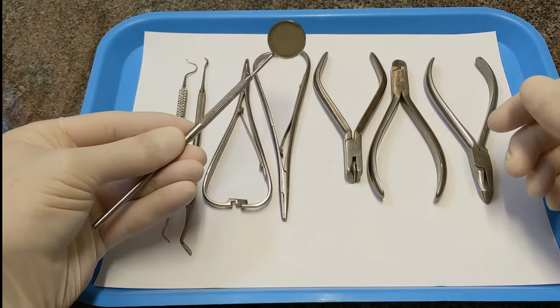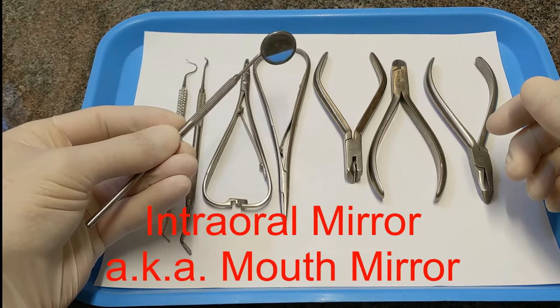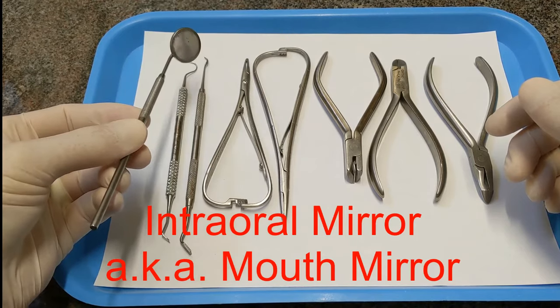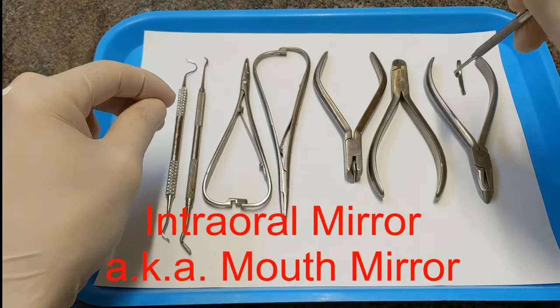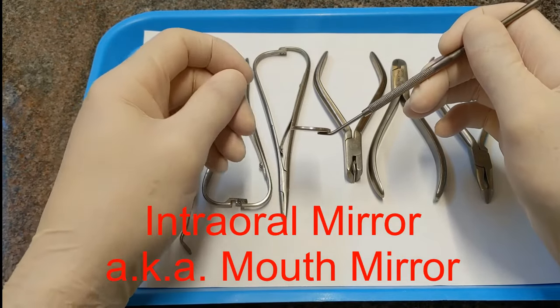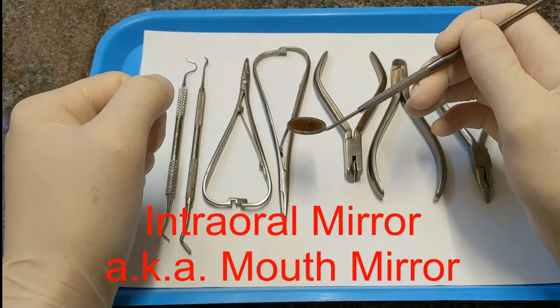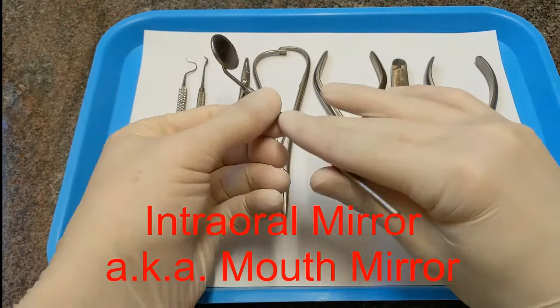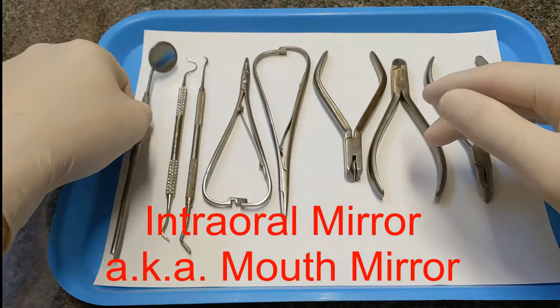First we have the intraoral mirror, or mouth mirror. This is used to retract people's cheeks, or to shine light on the back side of the teeth if you're working with a handpiece, or to look at the back side of the teeth or the retainer. It's the mirror you can use generally inside the mouth.